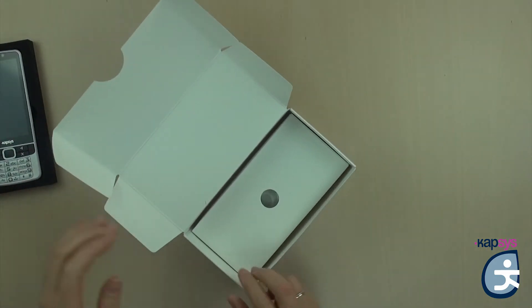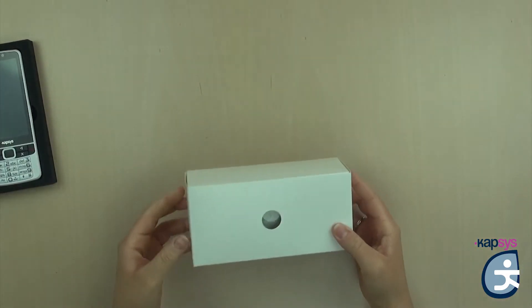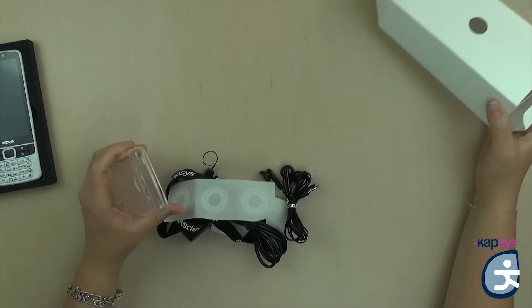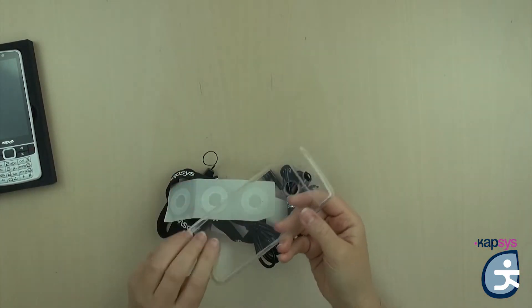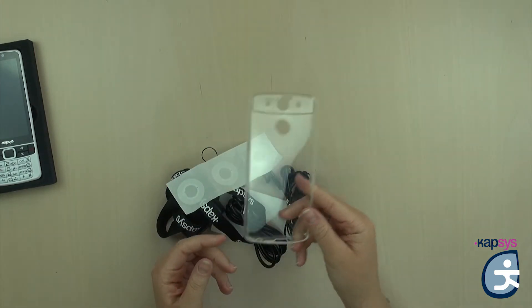Then you have the accessory box. The accessories box contains various elements. First, you have a small protective case in silicone to prevent breakage.